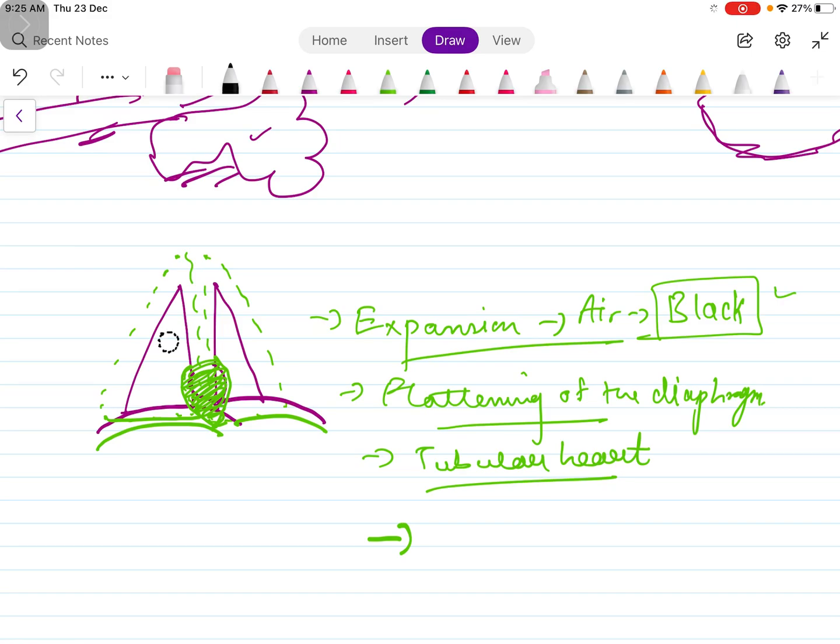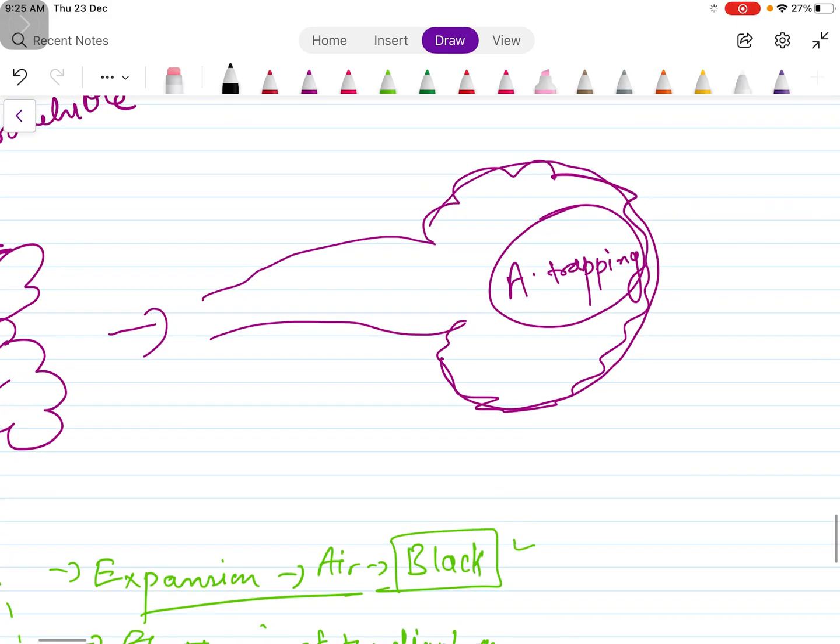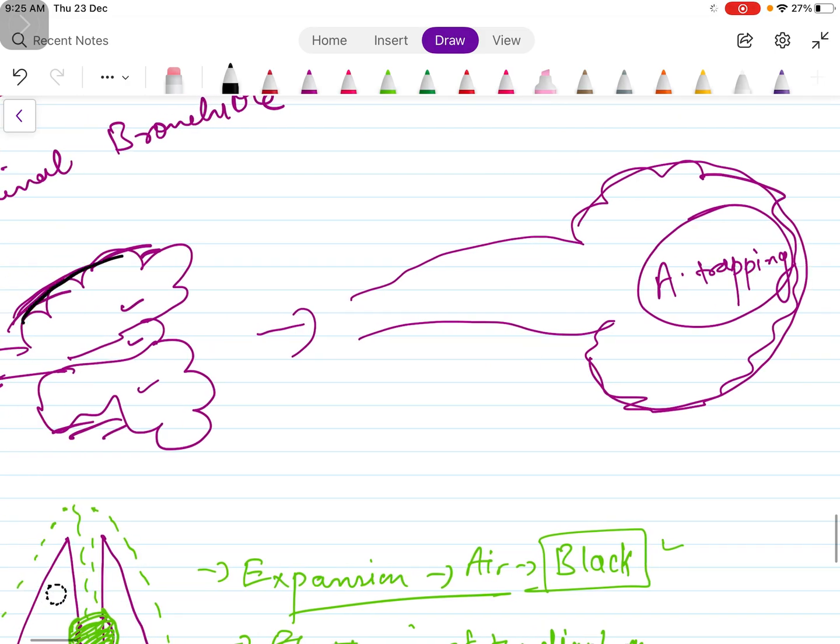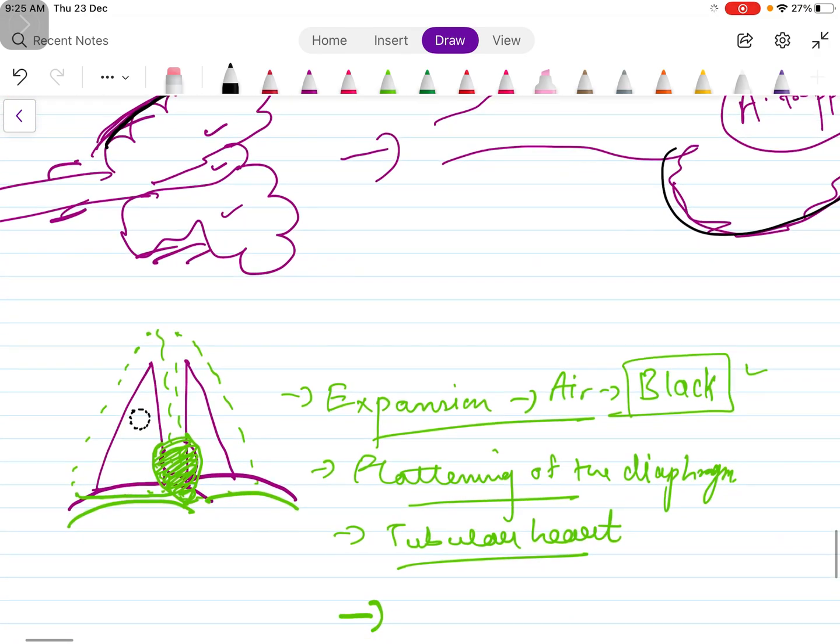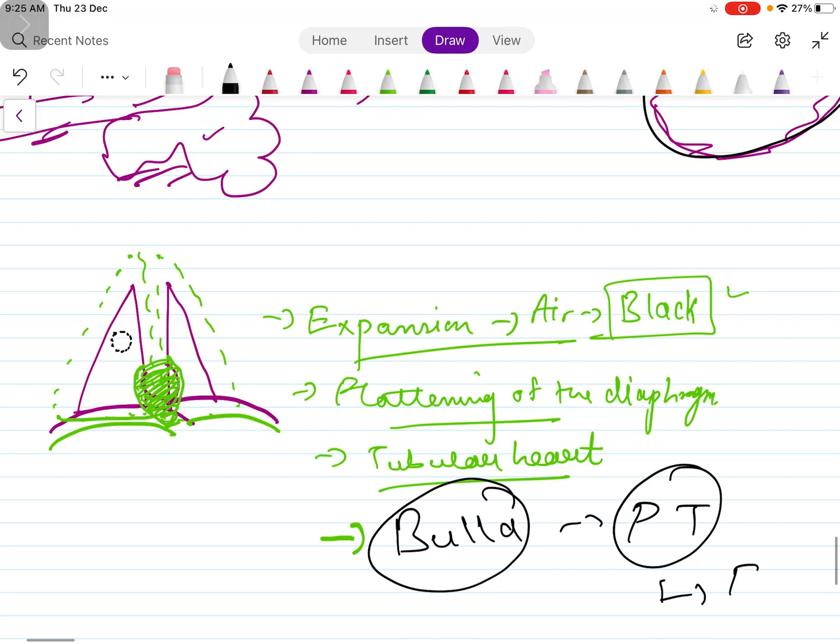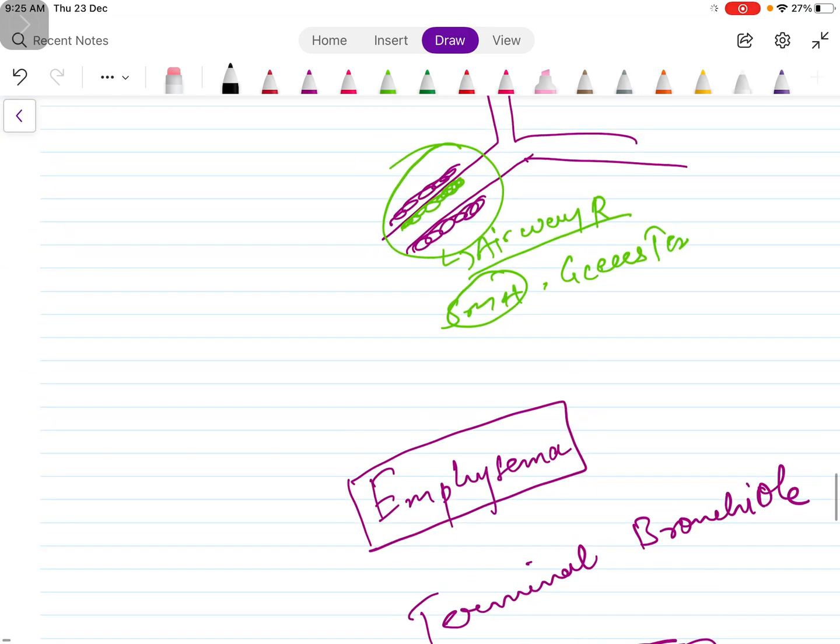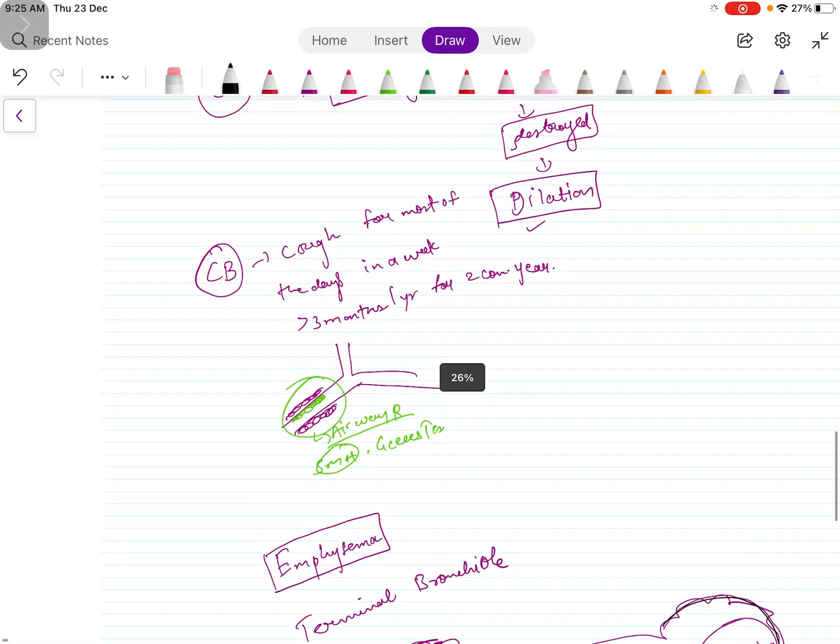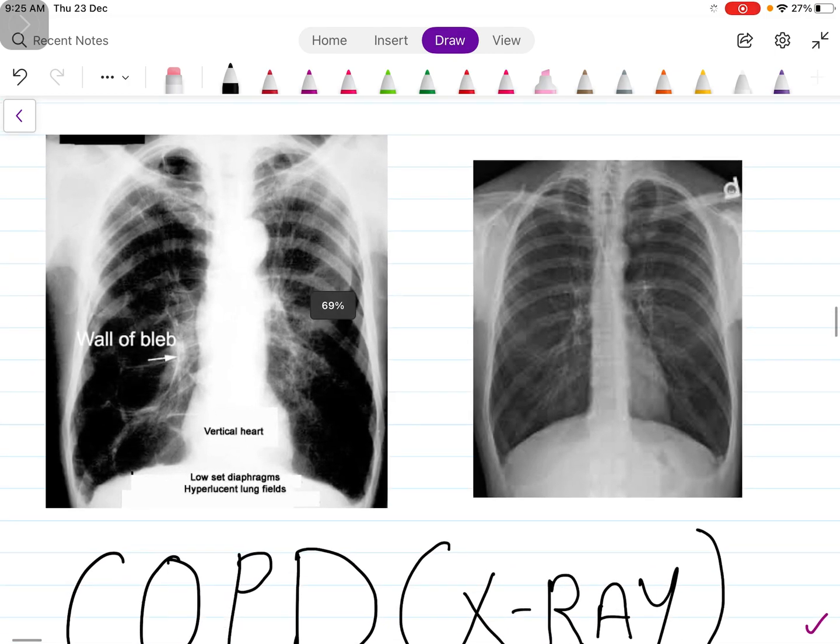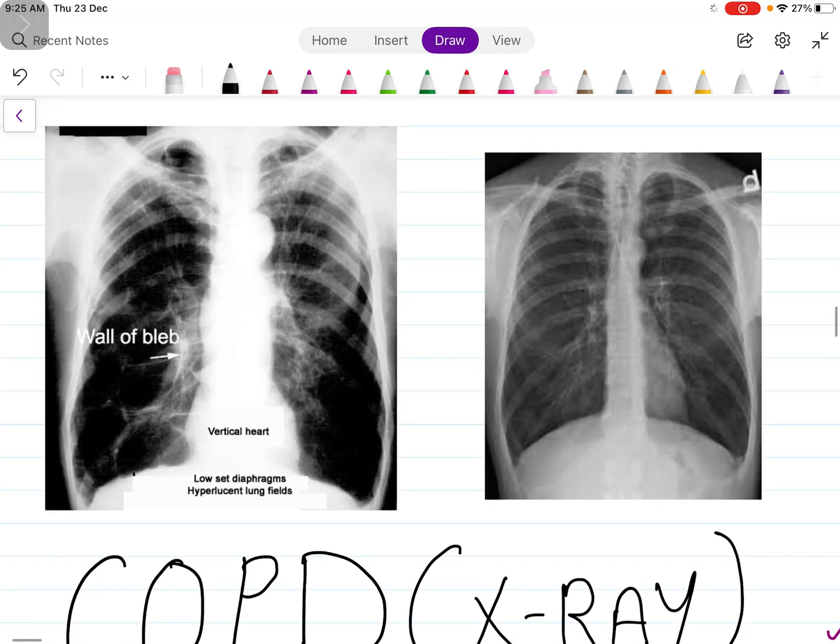Now let's see these findings in x-ray. I forgot something: there will be bulla formation. Because of the destruction of the alveolar septa, the alveolar lobules will come together and form a large space. This leads to formation of bullae. These bullae can rupture and cause pneumothorax in the patient, and this is an emergency condition. So with every COPD patient you should keep this emergency condition in mind, that is pneumothorax.